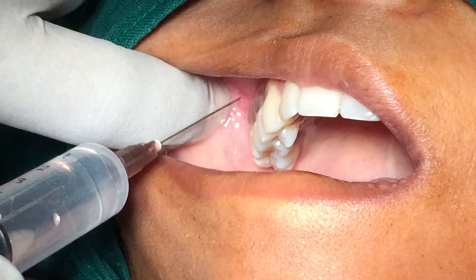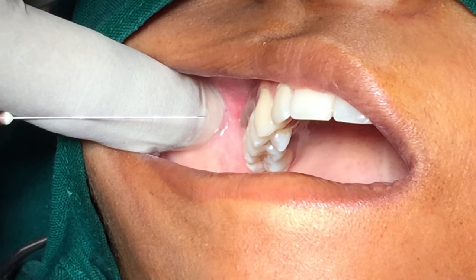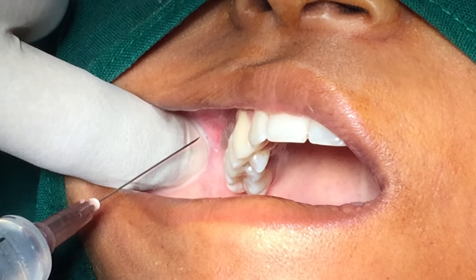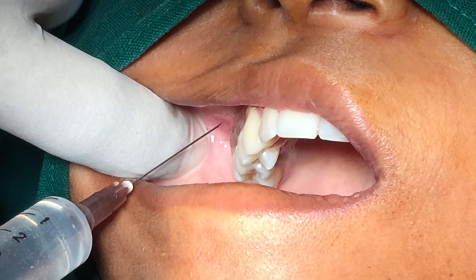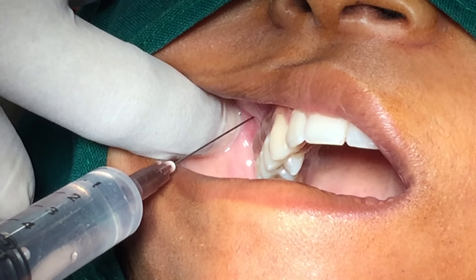The orientation of the bevel is towards the bone. Ask the patient to partially open the mouth, pulling the mandible to the side of injection. Retract the patient's labial mucosa and pull the tissue at the injection site.